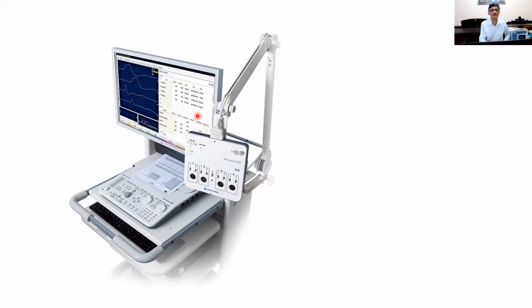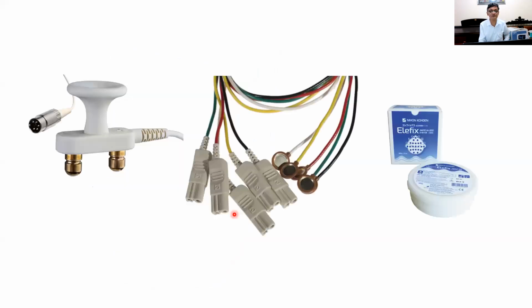You can change all those things. The fine technical details are not needed. But this is a junction box, just like in the EEG machine, where we connect recording electrodes and stimulating electrodes. And I will show you them.